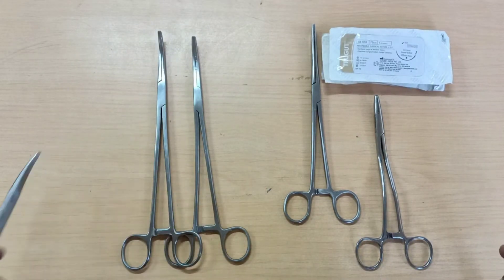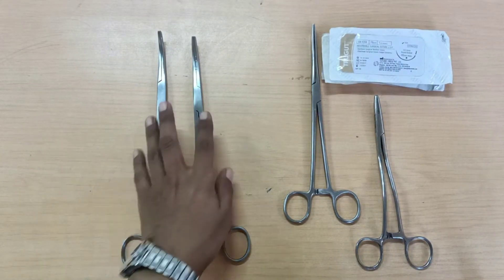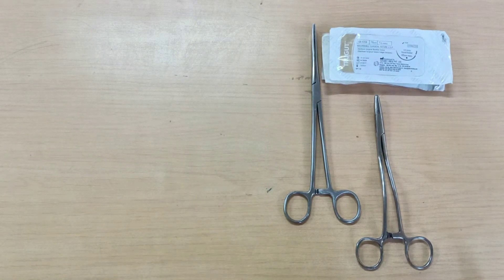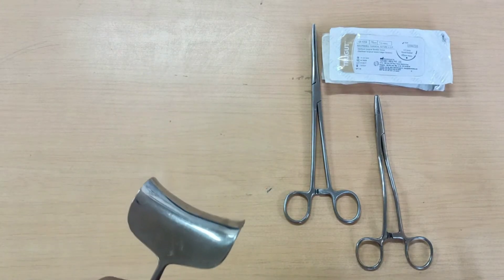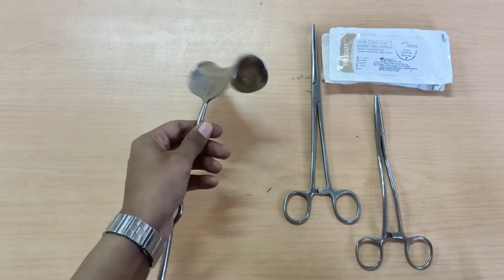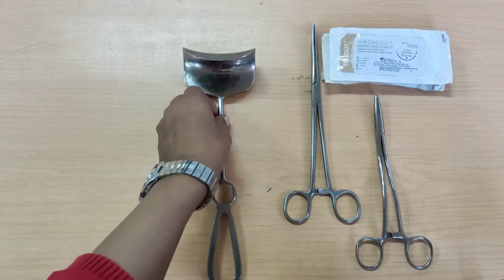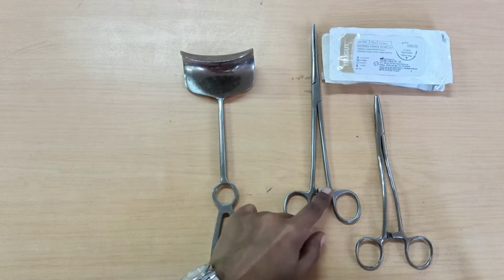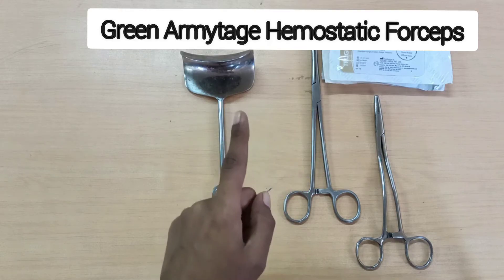Now the cord has been clamped. The next step is to put back your Doyne's retractor. The Doyne's retractor is now reinserted, and next you are going to take out the placenta and membranes. After taking out the placenta and membranes, you will require Green Armitage haemostatic forceps — four of them.